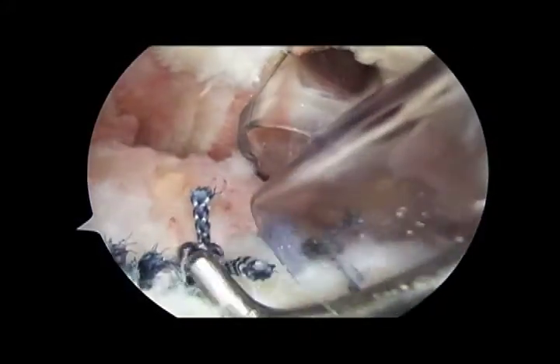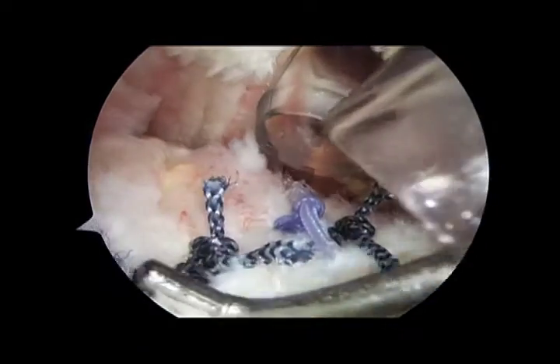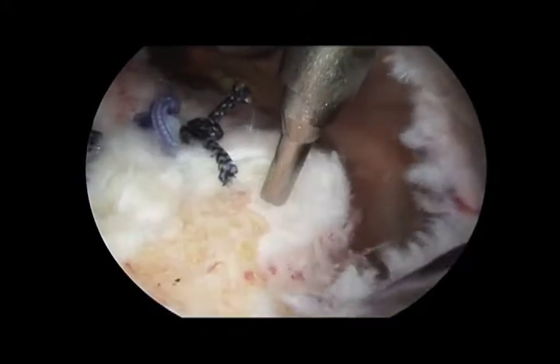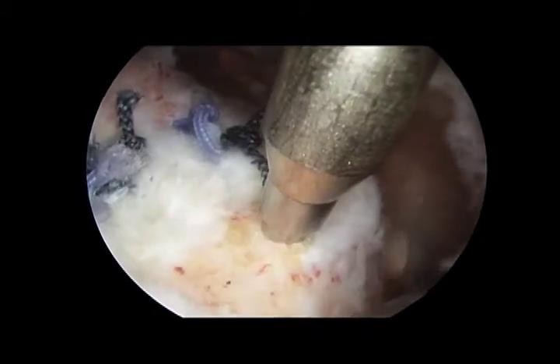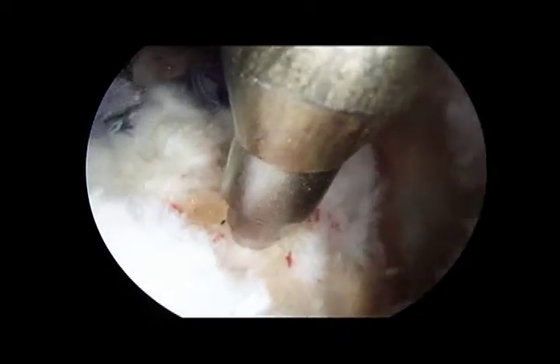The middle suture from the posterior anchor, which had been passed as a simple suture, was then tied. This was followed by the most posterior suture, which had been passed as a horizontal mattress. With all sutures tied, bone marrow vents are then placed in the greater tuberosity, allowing for the egress of marrow elements, including mesenchymal stem cells, growth factors, and platelets.